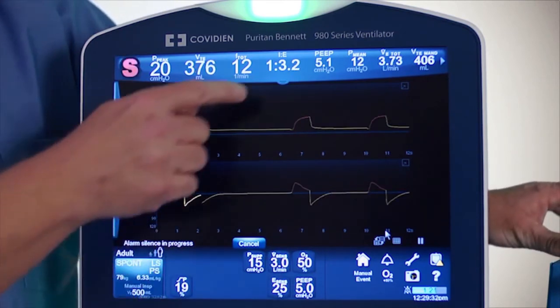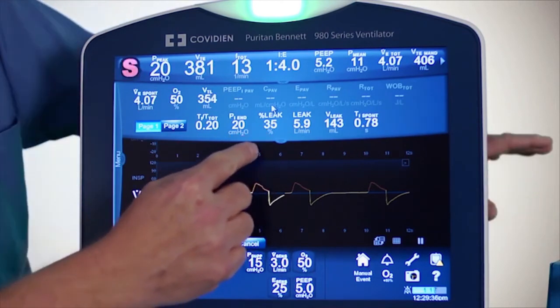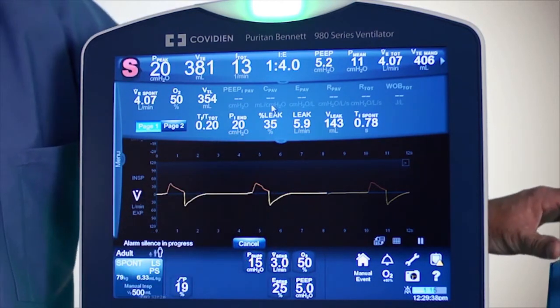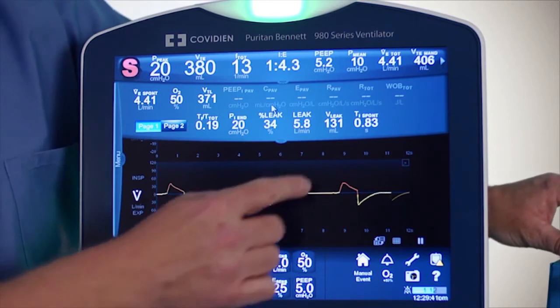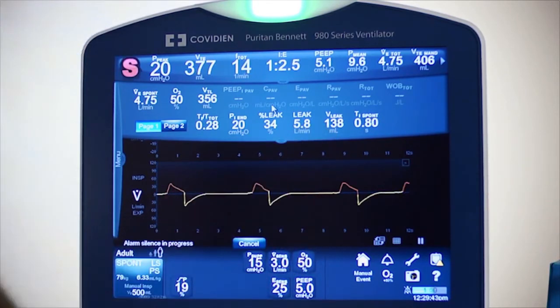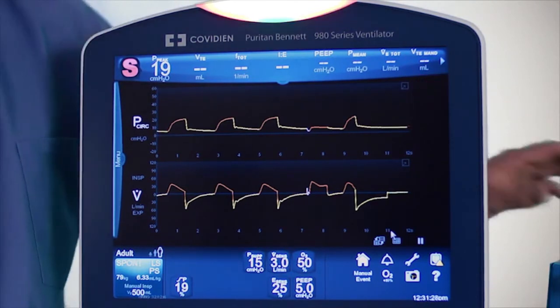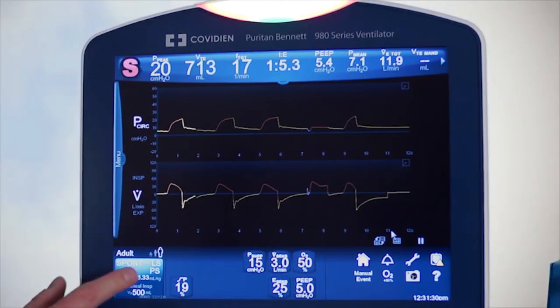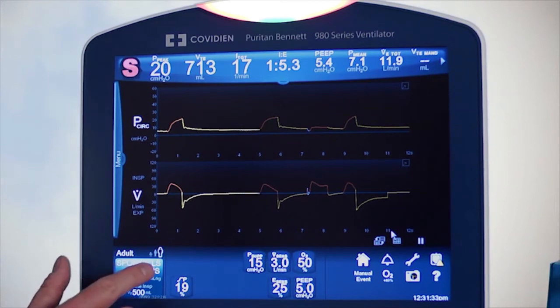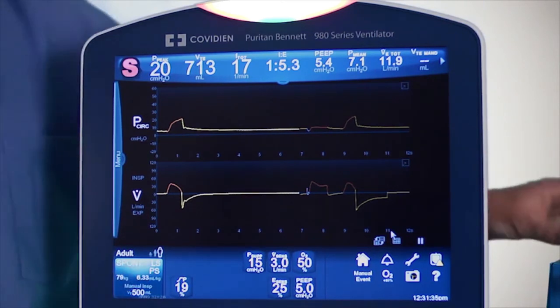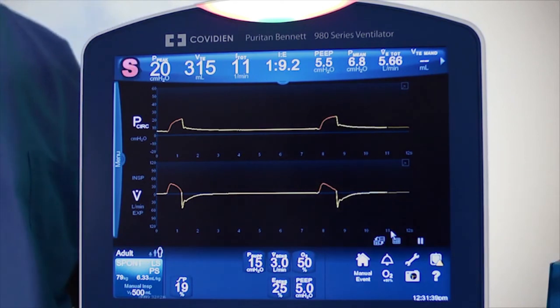With this leak, I can look and see the actual values: the leak percent is 35%, total is 5.8 liters per minute, and it's actually a 138 milliliter leak per breath. When you have the LeakSync software on, pay attention to the lower left-hand side — right next to the mode, you'll see 'LS,' which indicates that whatever mode you're in, the LeakSync software is actively being used.